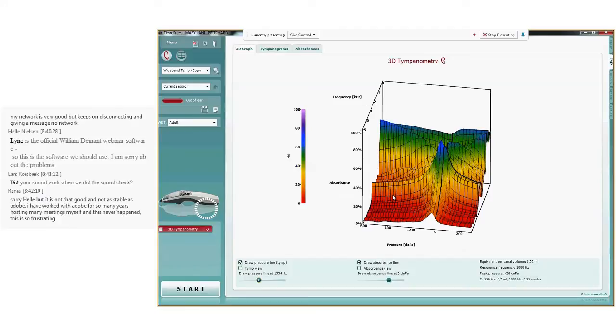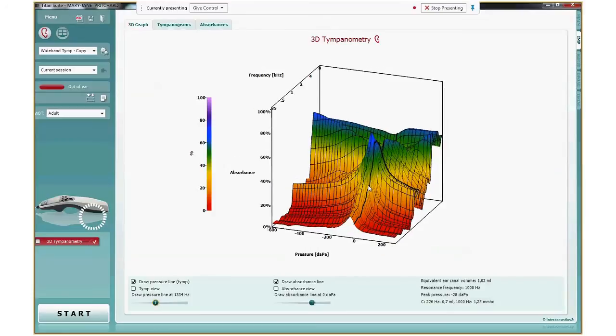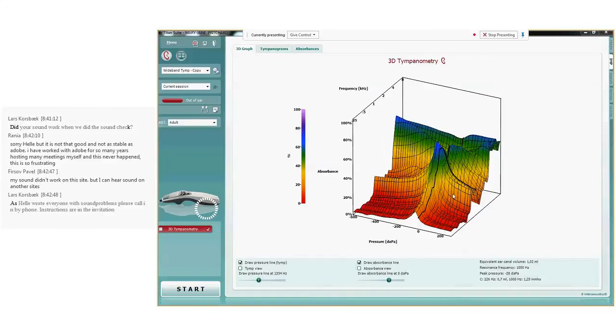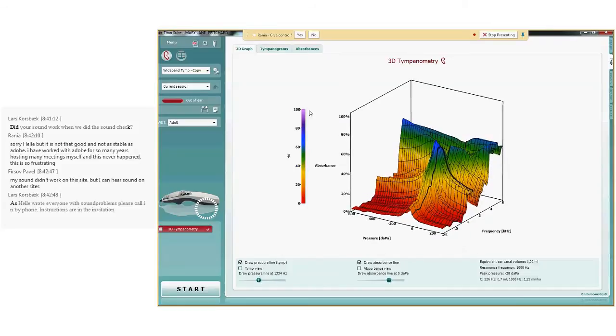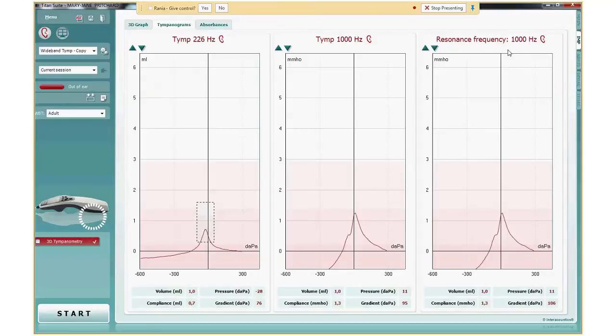Some people wonder if they have to understand these type of 3D graphs. The answer is no. It is really meant to be pretty. It is meant to impress people. And it is meant as a tool to explain to new users how wideband tympanometry is used. The useful information we present in an easier way, which is done with regards to tympanograms in the tympanograms tab. So what we see here is three tympanograms. I show the tympanogram at 226 hertz on the left. In the middle, I show the 1,000 hertz tympanogram. And on the right, I show resonance frequency tympanogram. That's a big coincidence that my resonance frequency is now measured at exactly 1,000 hertz as well.